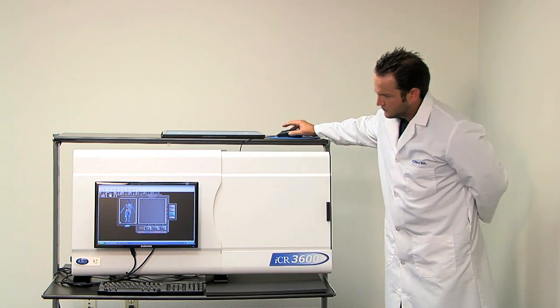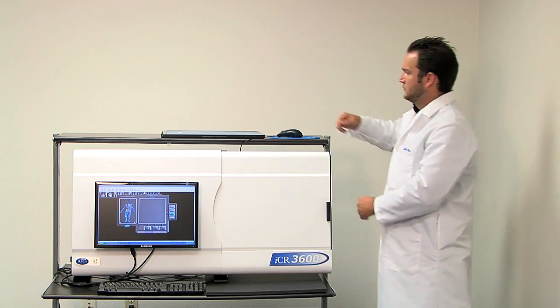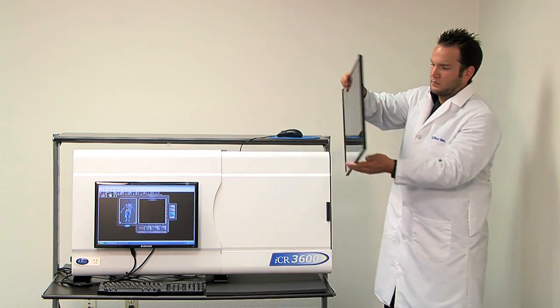While the cassette is scanning, your technologist can take another x-ray of the patient, improving your workflow and providing faster patient turnaround.